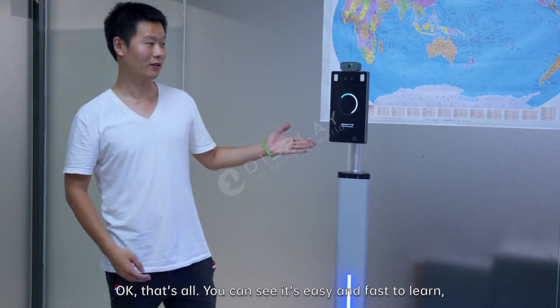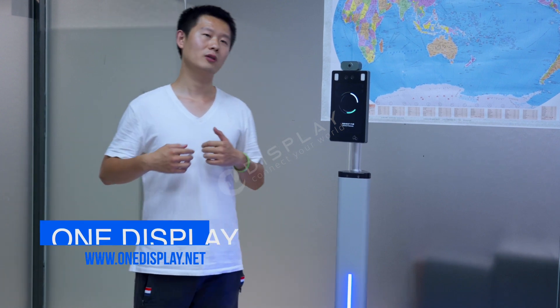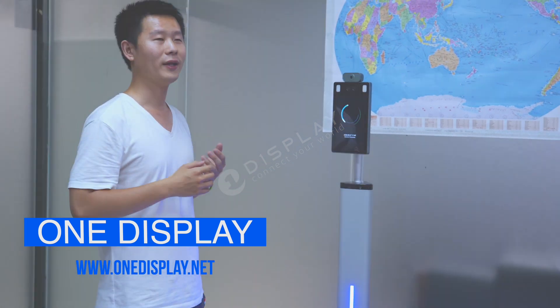That's all. As you can see, it's very easy and fast to learn. If you want to know more details about this machine, you can visit our website.